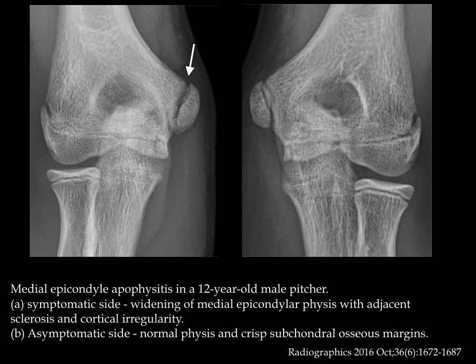In older children and athletes, we might see medial epicondyle apophysitis. Here we get widening of the medial epicondylar physis with adjacent sclerosis and cortical irregularity. Compare that to the image on the right — the asymptomatic side of the same patient — which is normal.